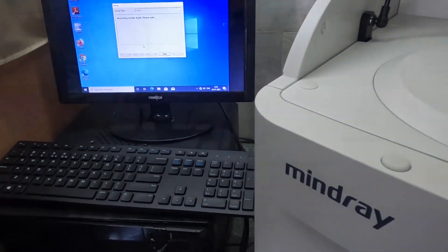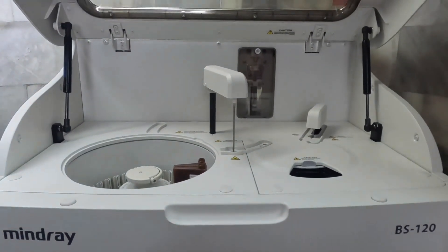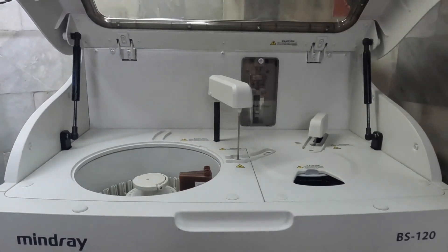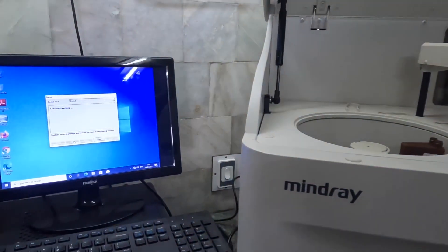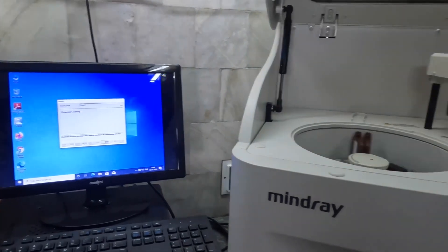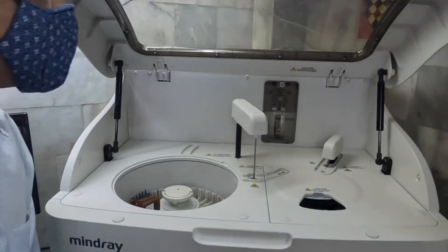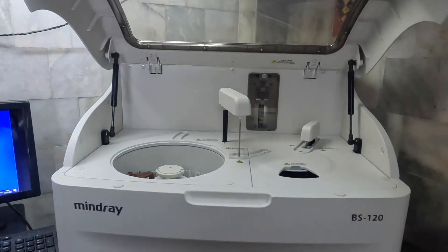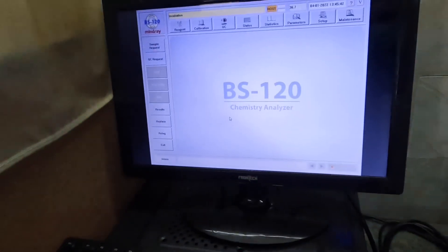Once the cuvettes are loaded, we check on the computer whether they are loaded correctly and give an OK. This is how the probe works — we have fitted the probe now. As mentioned, this is a reagent and sample integrated probe. It will take the samples and the reagent from the disc where they are placed, and it will clean after each reagent is taken.